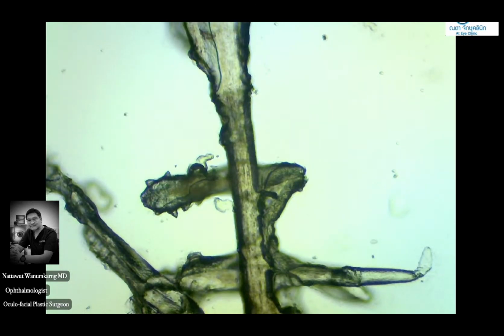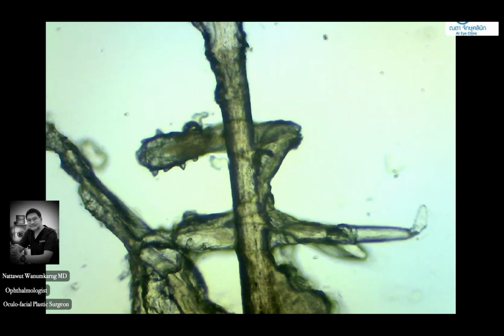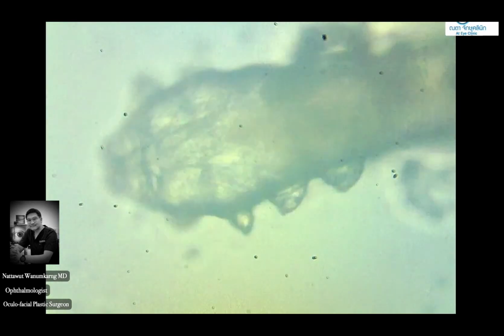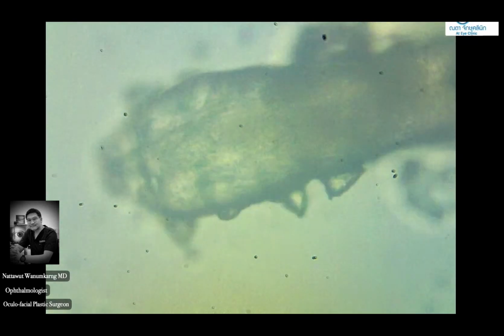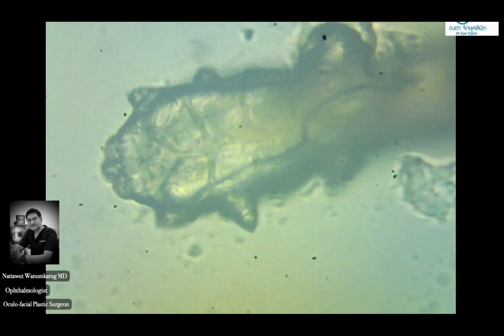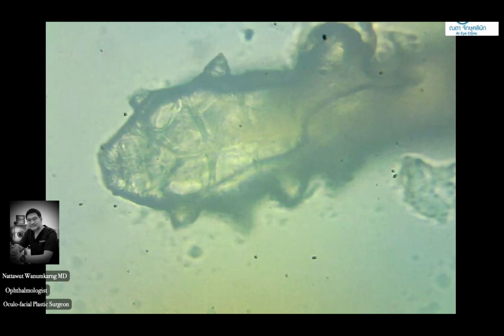You're going to see this is the slide that we left for maybe 1.5 hours. If we put the slide on immediately, we see the active movement of the legs of the Demodex. And this is slower because we put the slide on and left it for many hours, so the movement of the Demodex is slower. That's a part of the eyelid that we need to care for in the patient.